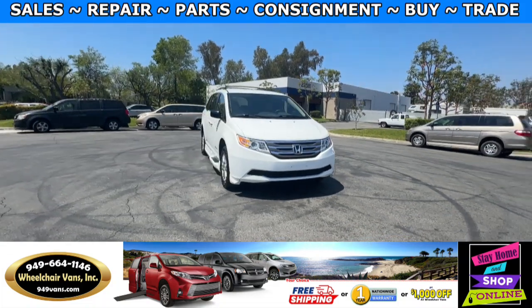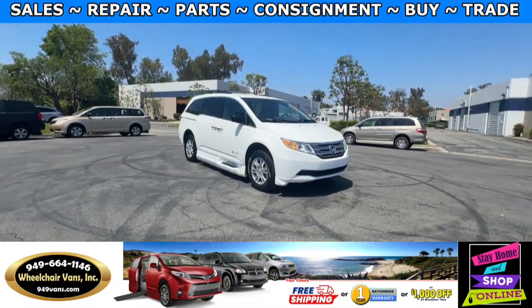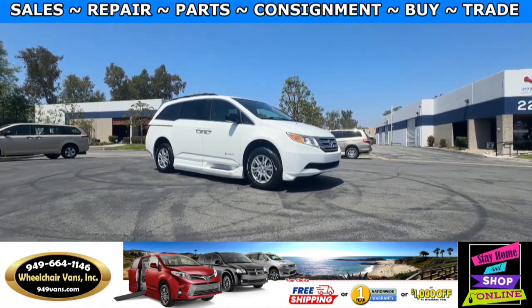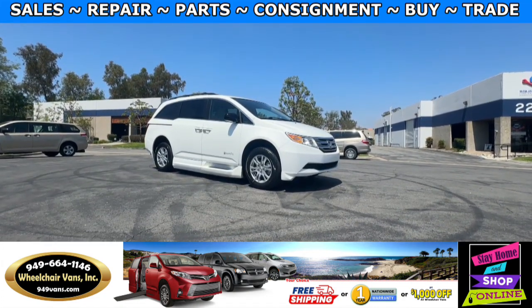Hello and welcome to Wheelchair Vans Inc. Today I'll be going over a 2013 Honda Odyssey equipped with the BraunAbility Power Foldout Ramp.